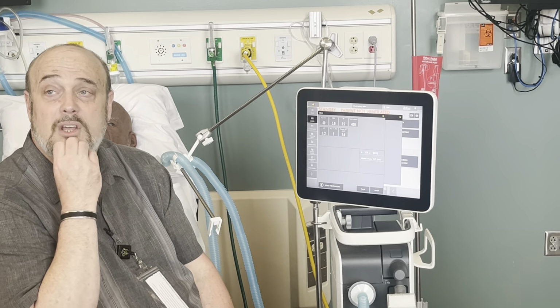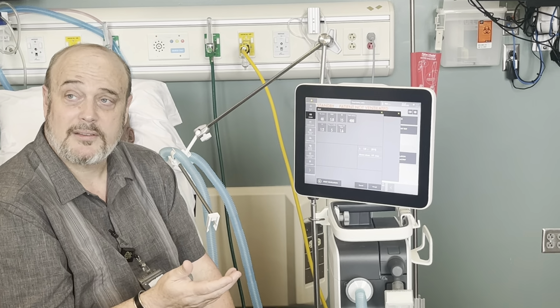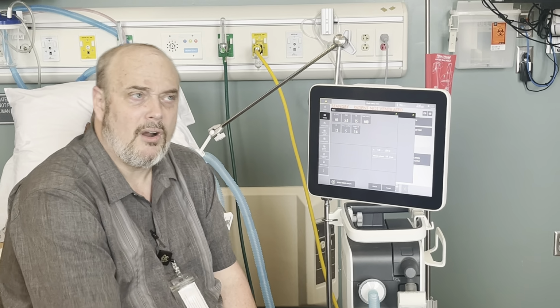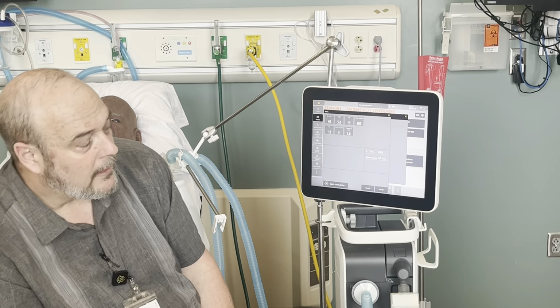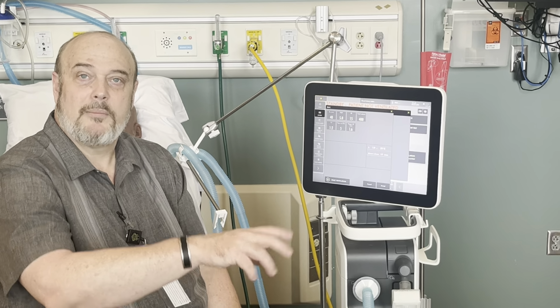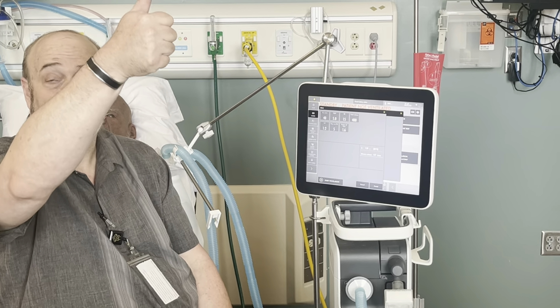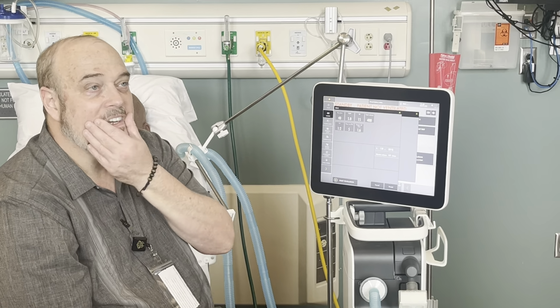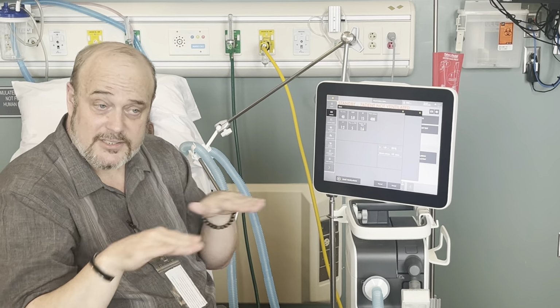And I'm going to tell you, that's good to know, because whenever you get an asthmatic patient or something like that, like Dr. Roberts, it happened with me and him. We went there, he said, Carl, how come the patient's not getting the volume? I was like, oh. And he had tried to adjust the volume, and then I turned up the high pressure alarm, and then she started getting her volume. So just know that it's not only an alarm, but it actually cuts off as well.